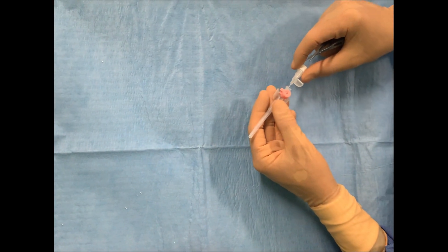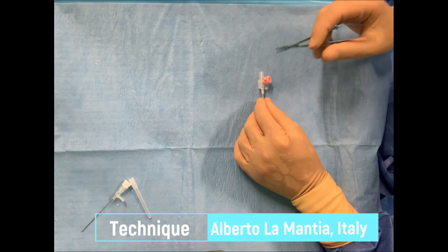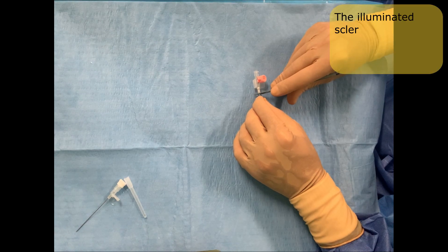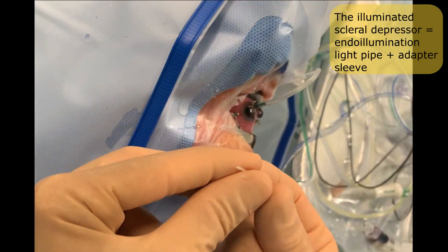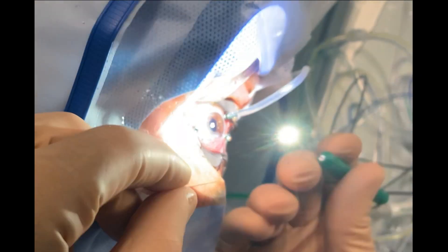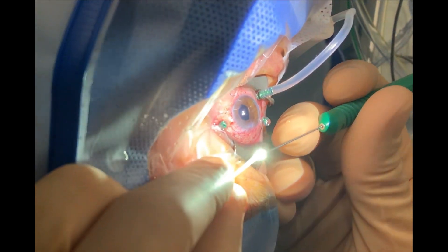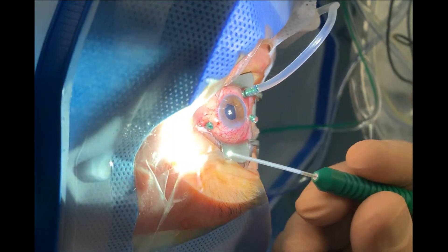Besides a stationary light system, an external illuminated scleral depressor can also help perform non-assisted vitreous-based shaving. The illuminated scleral depressor consists of an illumination light pipe with an adapter sleeve. The idea of the sleeve is to protect the light pipe from damage while depressing the sclera, and also to prevent iatrogenic scleral injury, which is possible in highly myopic patients.